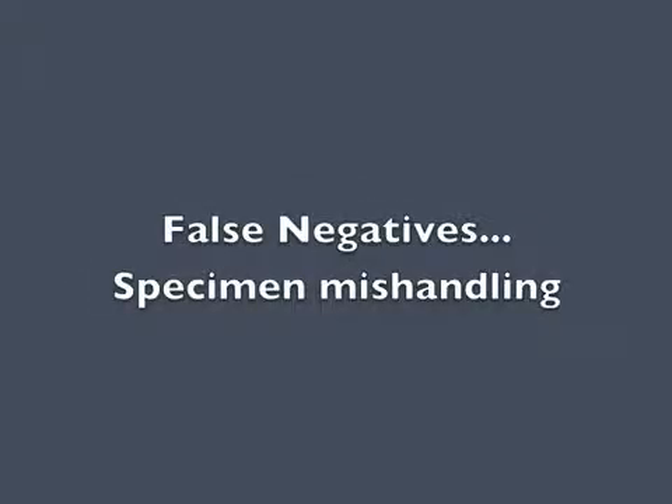False negatives can occur when the specimen is mishandled or exposed to light for too long and bilirubin breaks down.